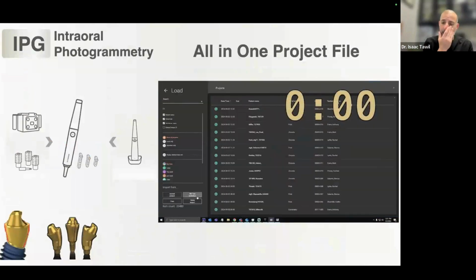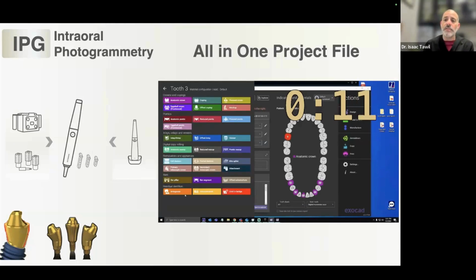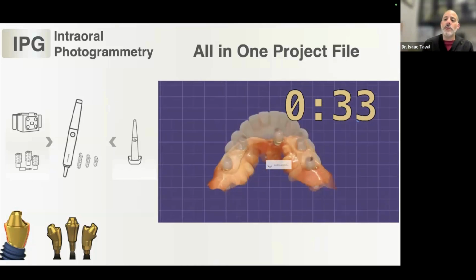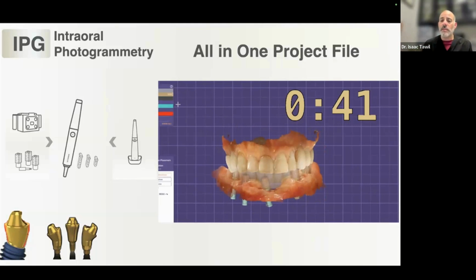So this is about how long it takes. Once the clinician sends over the files, you go ahead and pick your antagonist. You might pick your Pontics and all of that. And this is more real time. And then it opens as fast as your computer can open it. So this is about 40 something seconds, and we have all the files stacked and matched all in one file. It makes it much easier, and you guys can do what you really want to do, which is get to design, get to work instead of matching, which just takes a little bit of cumbersome time. If it didn't match correctly, of course you can realign it, but at least what I've seen is that they come through all the time matched properly.